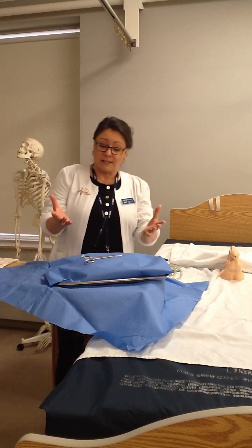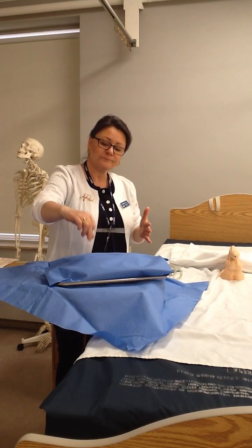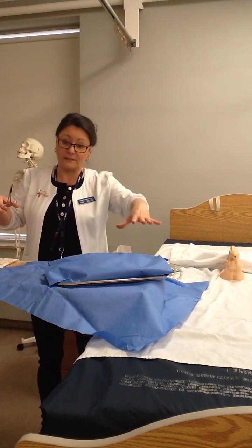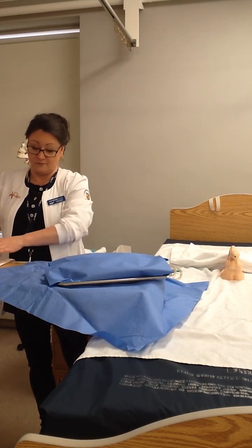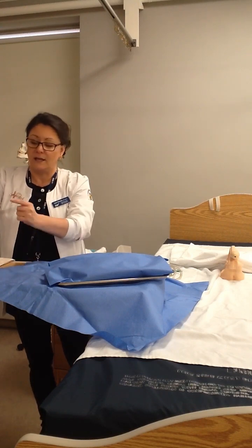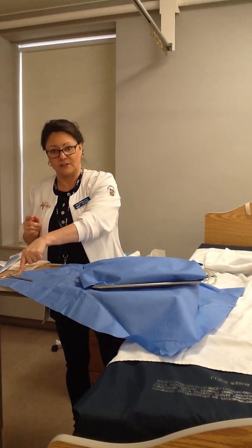So now we're going to look at the inside drape. We have our tool here that we can use. I'm going to pick this up now. So now I have an unsterile end, and I have a sterile end. And I have a sterile field inside, and I have a 1-inch unsterile border running all along the outside of my tray. So if I have to set my tool down, I'm going to make sure that I set the sterile part down well within the sterile field and the unsterile part well outside in the unsterile field. Sterile can touch sterile, unsterile can only touch unsterile.